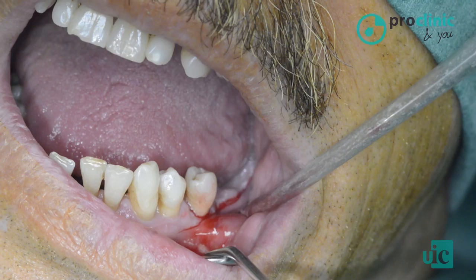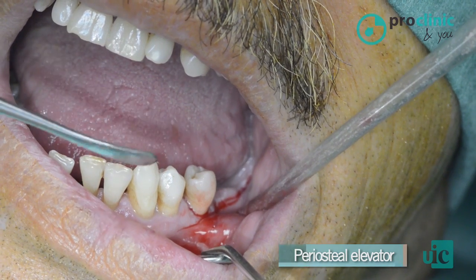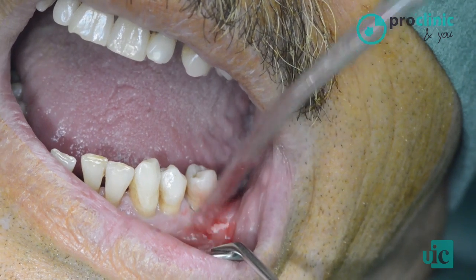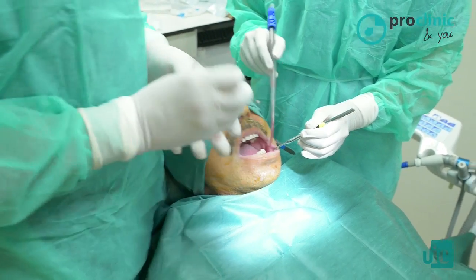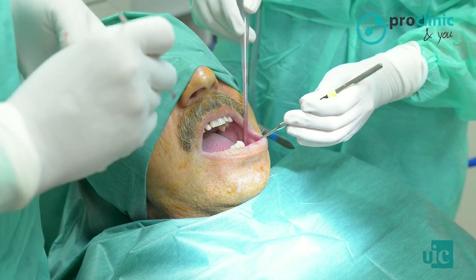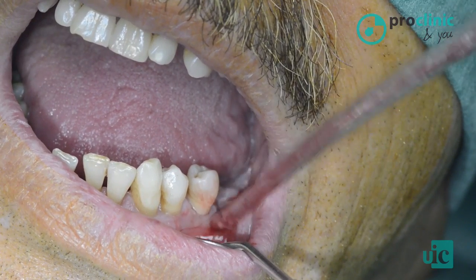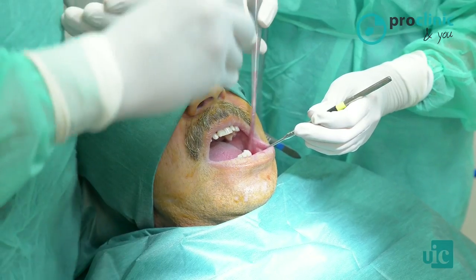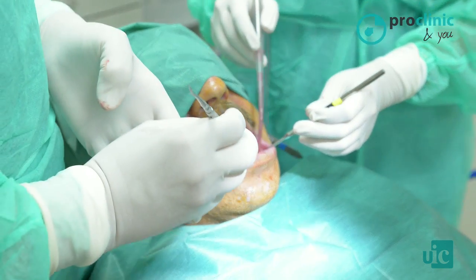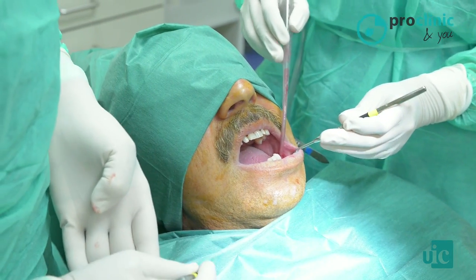We can also perform the syndesmotomy with a periosteal elevator, which is quite sharp. This one is a Freer periosteal elevator that allows us to penetrate into the gingival sulcus and tear the soft tissue junction by syndesmotomy. We are going to do it with this. We are also checking if the patient is correctly anesthetized, because if the patient feels pain or discomfort, he is going to tell us something at this point. All right, Antonio?